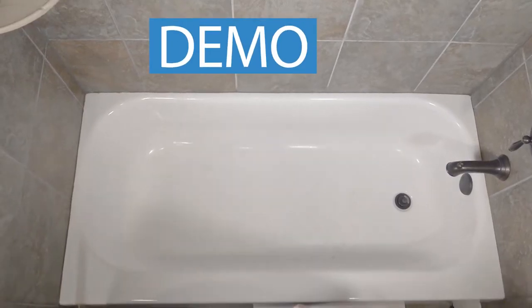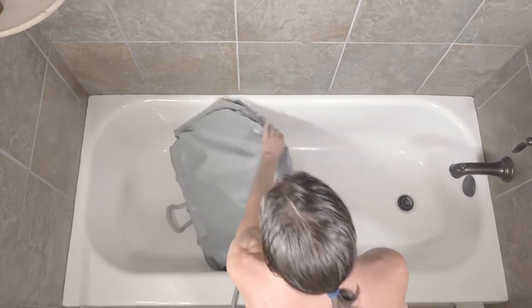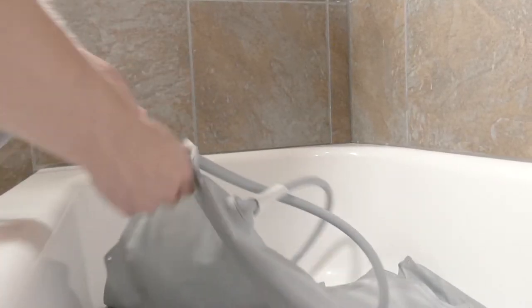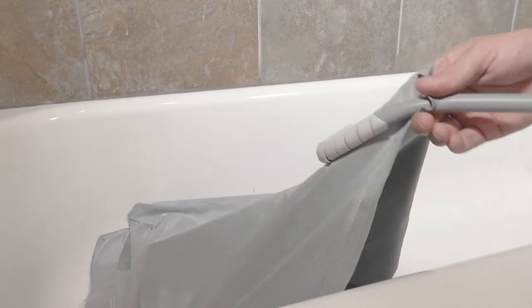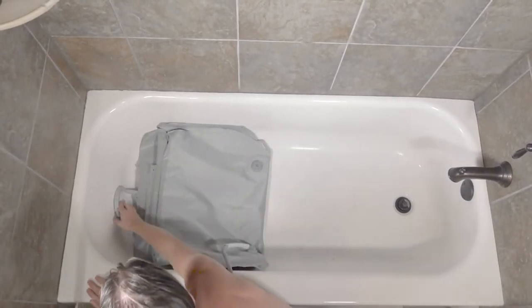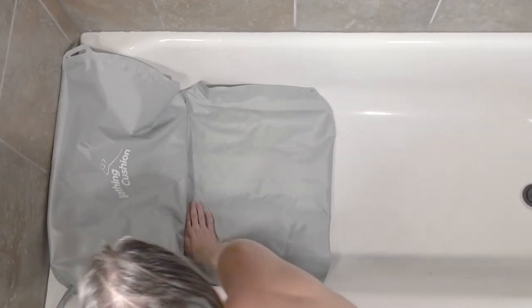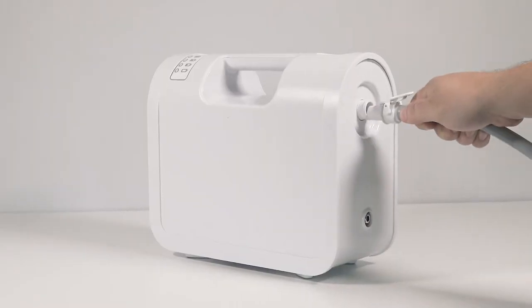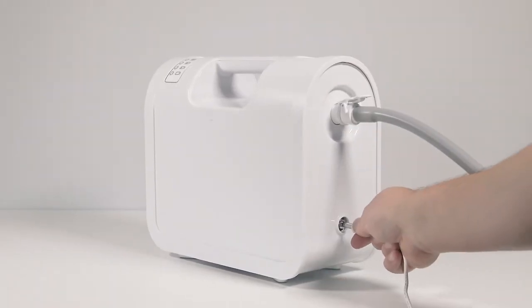To use the bathing cushion, first place the folded cushion in the center of your tub and run the tubing through the loop on the side you plan to enter and exit the tub from. Use the handle to pull the bathing cushion backwards and fold the backrest out. Then firmly press to adhere the four suction cups. Connect the air hose and controller to the airflow 12.